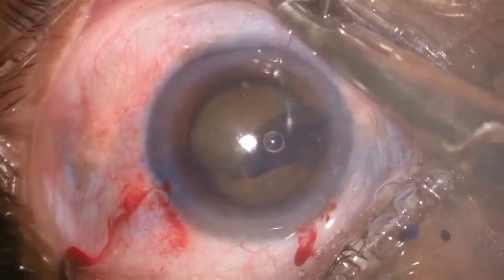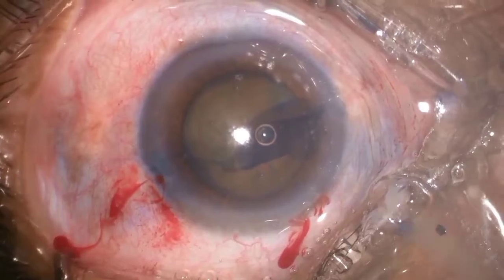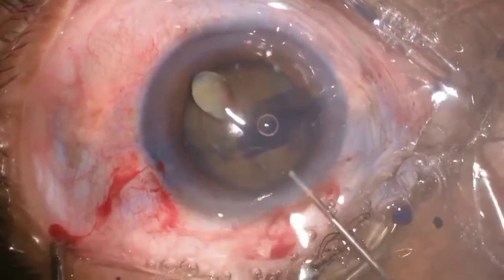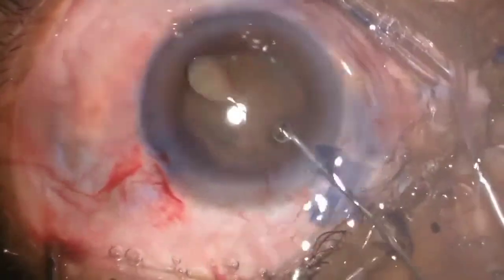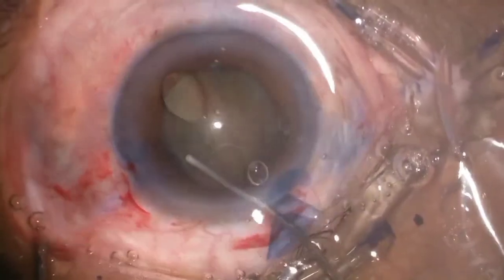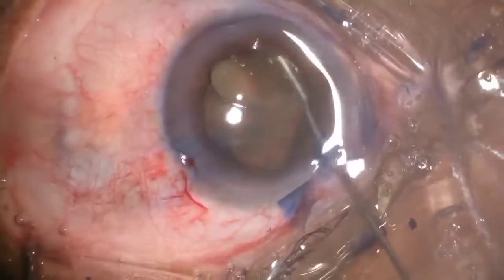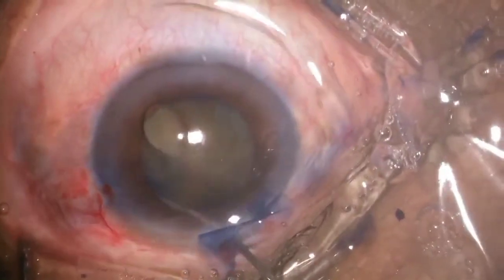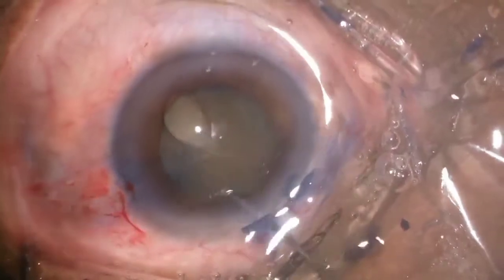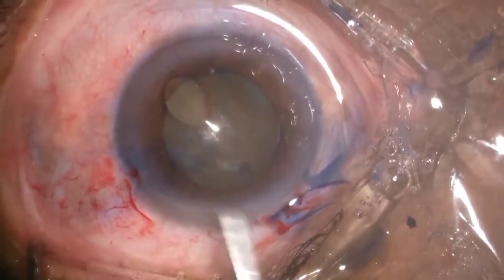The problem I was having is that I was not able to see the posterior capsule. When I was doing the rhexis, I was not seeing any fluid wave, so I was doing multiple hydrodissection to confirm that at least a fluid wave would be there.